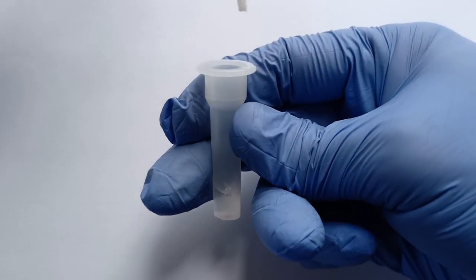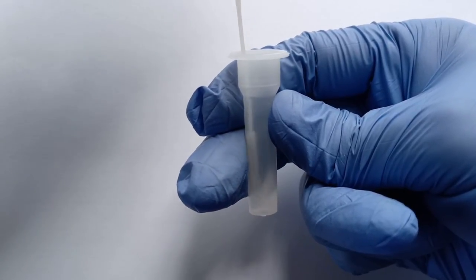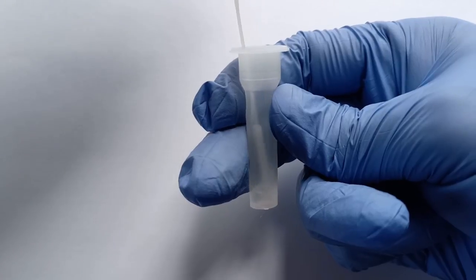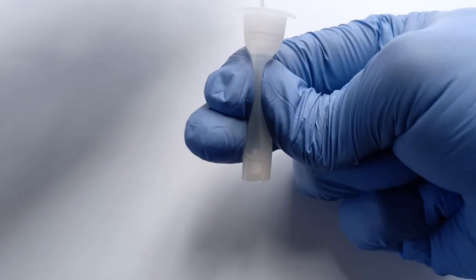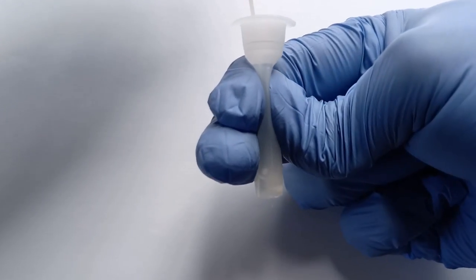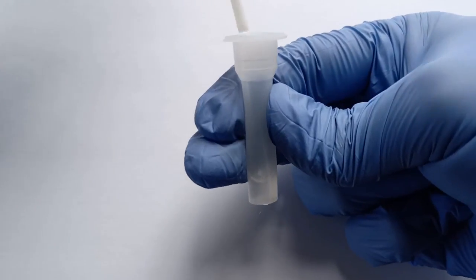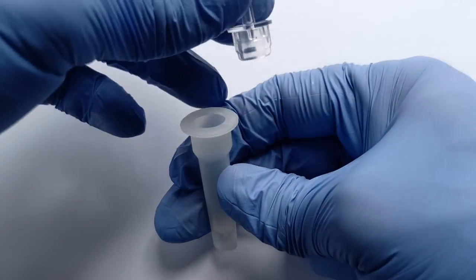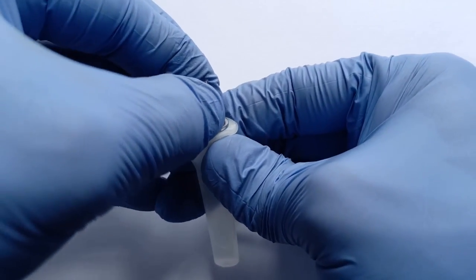Immediately dip the cotton tip of the stick into the extraction buffer liquid and gently agitate the buffer in a circular motion about 5 times. Squeeze the plastic tube just below the mouth and forcefully pull off the swab stick in order to extract as much residual liquid from the cotton tip into the buffer tube as possible. Now tightly cover the tube with the nozzle cap provided and then gently mix the contents of the tube for a few seconds.